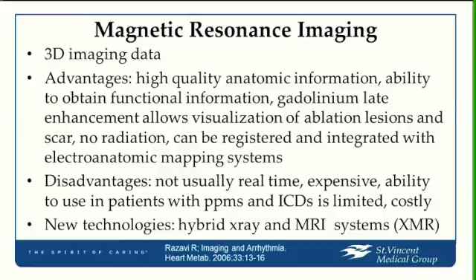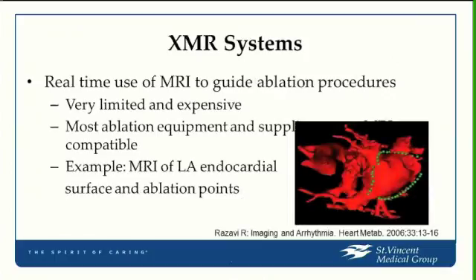And then there are some very fancy new research systems. They call them XMR systems.